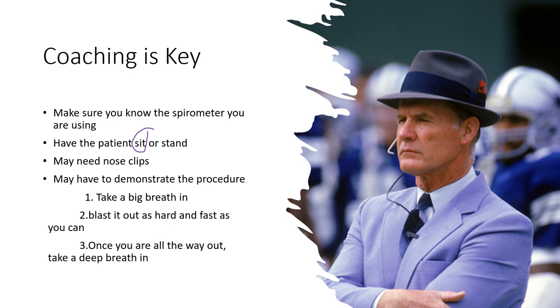Nose clips are usually preferred for most PFTs. Once again, air can escape through the nose, the nasopharynx, so you can both entrain and exhale through the nose. By giving them nose clips, you avoid some of that loss of volume or flow rates, so the only gas going in and out is through the mouthpiece. That's the goal, and that's why nose clips are preferred.